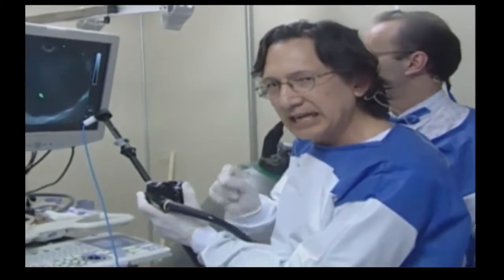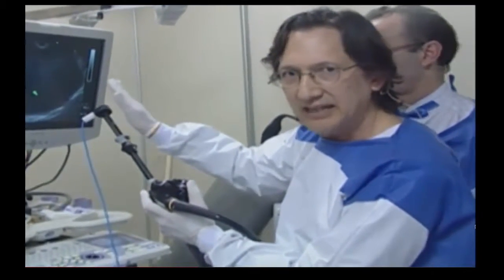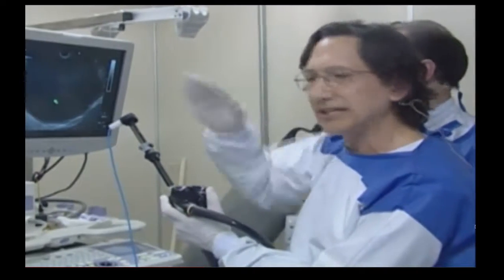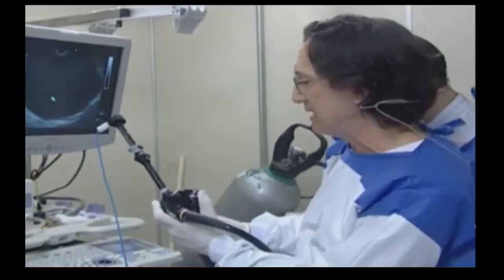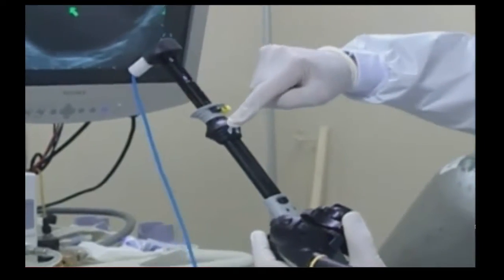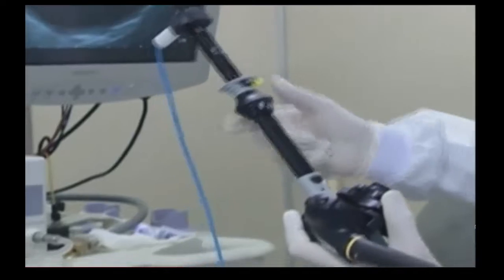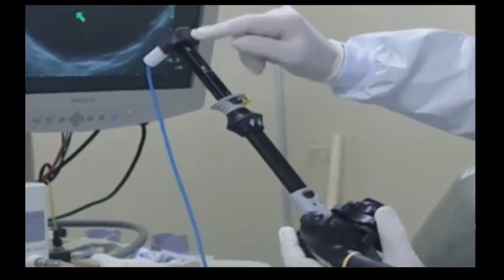So the idea here is that everything is done under ultrasound guidance. Place the stent. After the stent is placed, then you go through the stent and do the entire examination endoscopically and not radiologically. All right, so the first stent, this has 2 different components. There are 2 hubs, hub 1 and hub 2. This first distal part here advances the sheath forward. This more proximal part deploys the device, the stent.